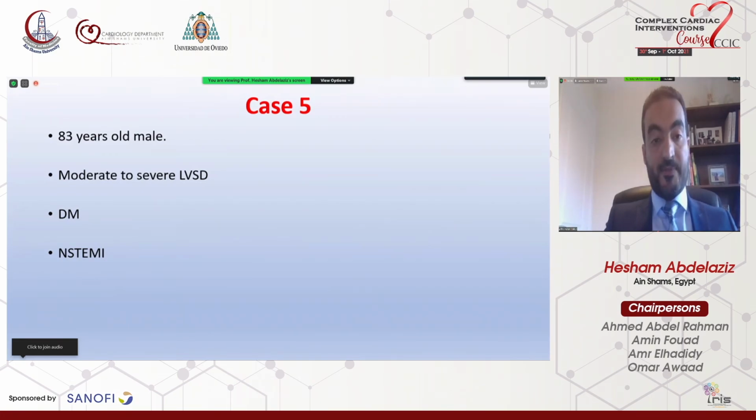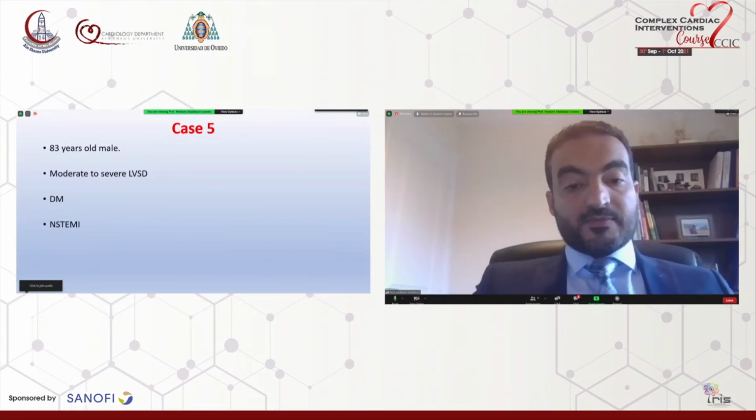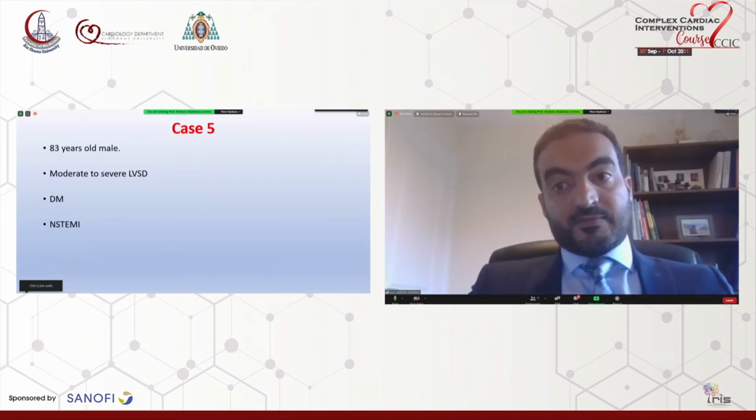The question, depending on your presentation of zero contrast in these complicated cases and the use of certain investigations like the IVUS and so on to do that, this is not done routinely in our cath lab.